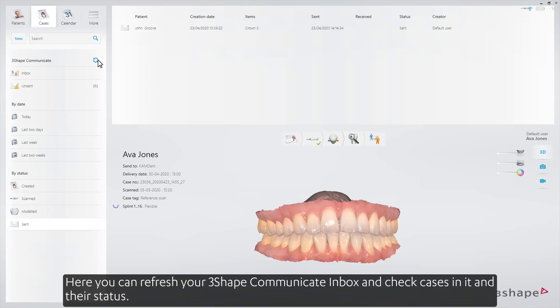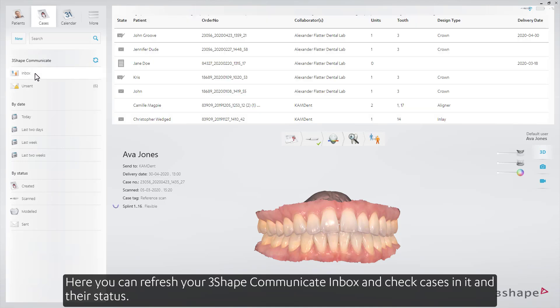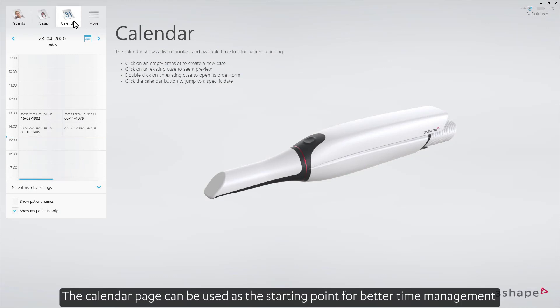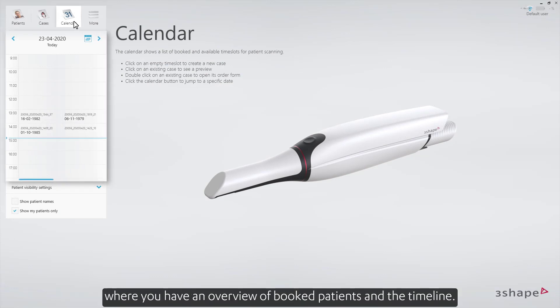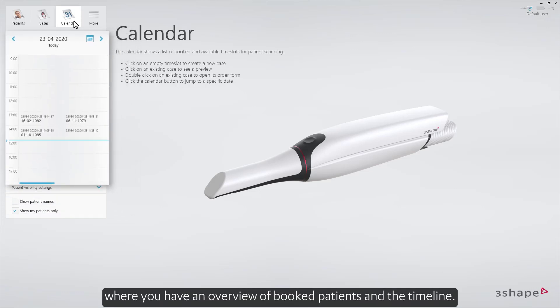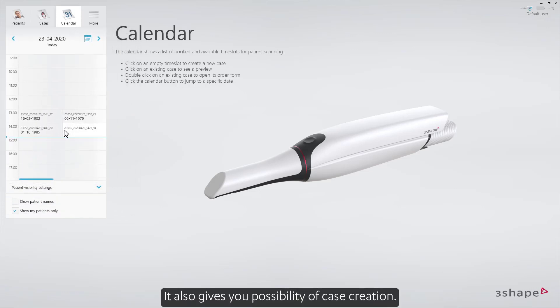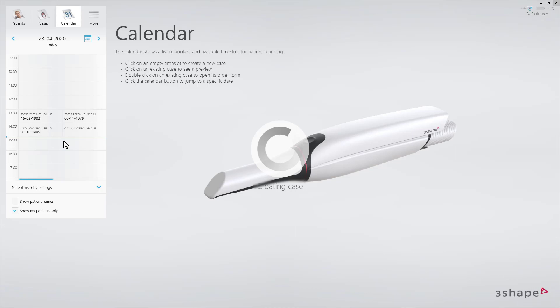Here you can refresh your 3Shape Communicate inbox and check cases in it and their status. The Calendar page can be used as the starting point for better time management, where you have an overview of booked patients and the timeline. It also gives the possibility of case creation.